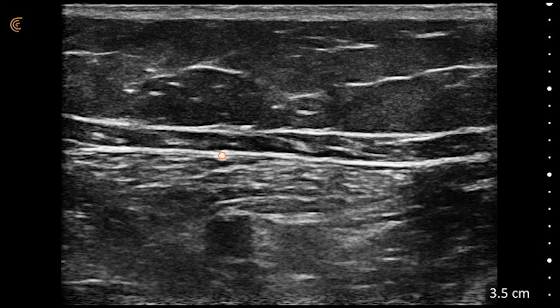Here you can see the sartorius. We've got our femoral artery right here in the middle of the sartorius, about mid-thigh, and our saphenous nerve.